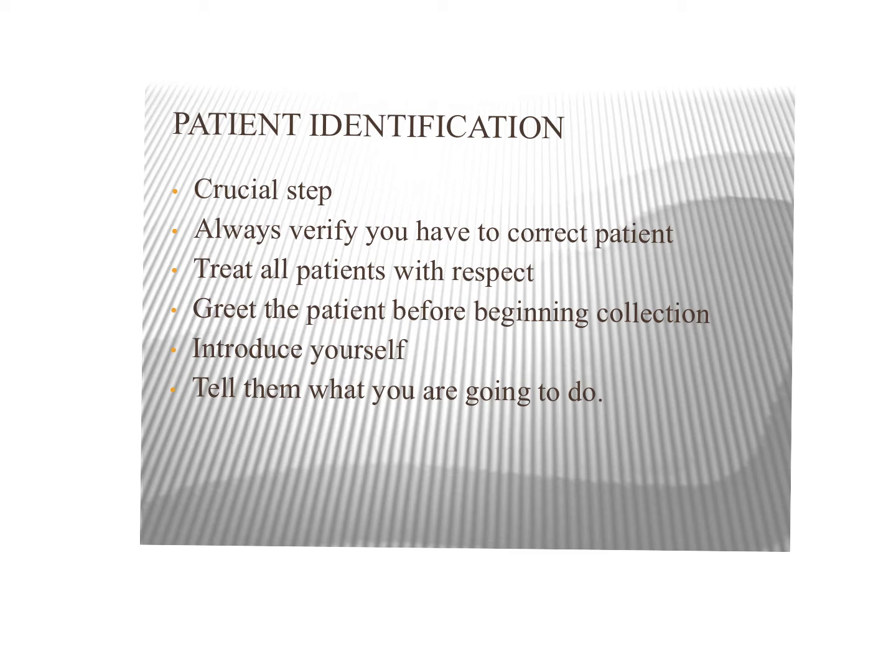And unfortunately, if we draw blood on this patient, let's say at 2 o'clock, and we have to come back in at 6 o'clock to draw that same patient again, we need to do the same thing. Okay, we need to check their requisition form, and we need to have them state their name and birthday again. It's just kind of covering our butts, because again, we don't want to draw blood on the wrong person, because then we're delaying testing and those types of things.